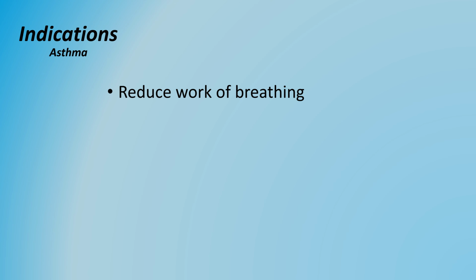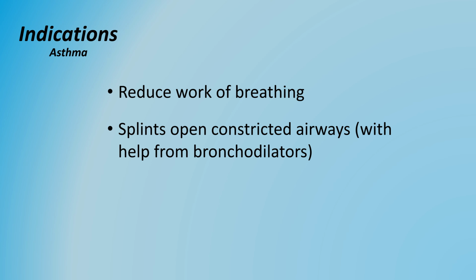Firstly, it's going to reduce the work of breathing for them. Clearly, it's much easier to breathe in when there's oxygen being forced into your airway. This is also going to take a whole load of pressure off of the inspiratory muscles that have been working overtime. CPAP is going to splint open constricted airways, allowing some trapped air to escape.